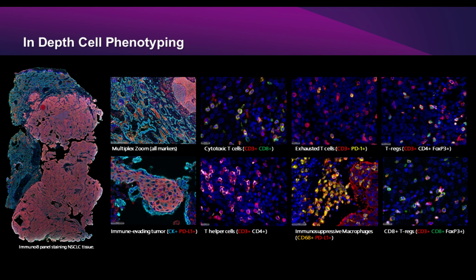That's what makes the optimization quite difficult, and it can skew what you're observing from a biological perspective. You're basically turning a low expressor into a brighter expressor, and turning a high expressor down into more of a medium expressor, just to be able to unmix the image.